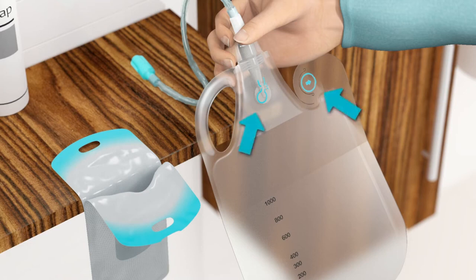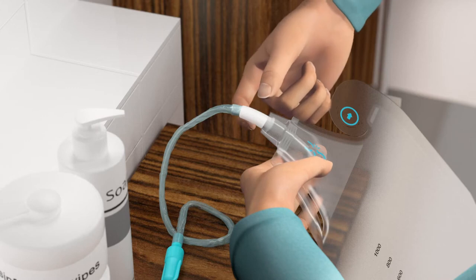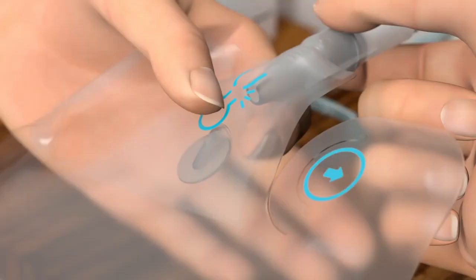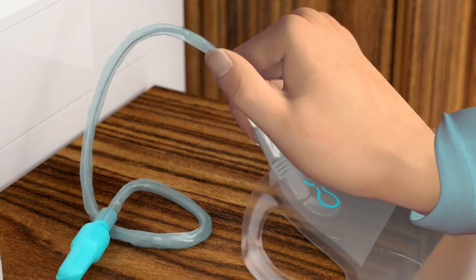The turquoise symbols printed on the bag indicate action points. Before you can use the catheter, the sealing between the catheter and the bag must be broken. Take a grip of the internal tab inside the bag and bend it firmly from side to side until you feel that it breaks off. Please check that the tab has loosened completely. If you find it easier, you can place the bag on a plain surface and break the internal tab off by using your wrist.